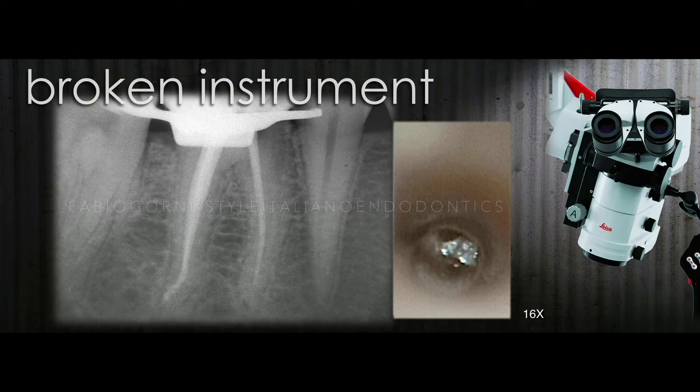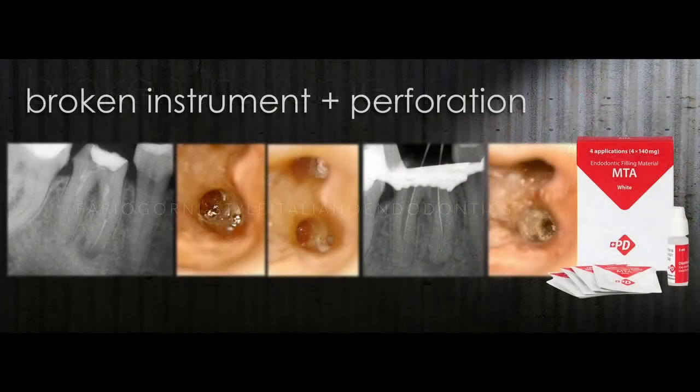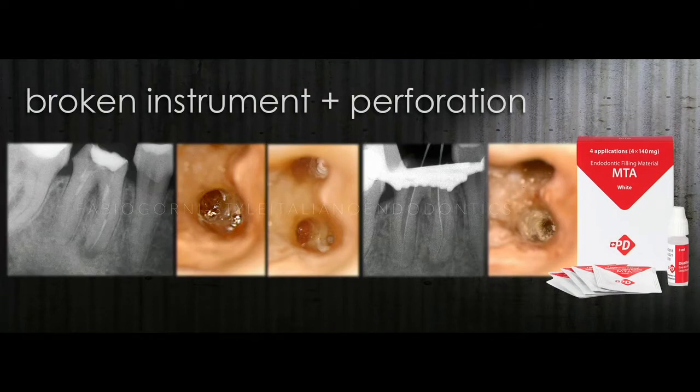When it happens, try to understand exactly if it's possible to realize our project and remove the broken instrument, or if we have to face the case in another way. This is the typical case that I want to show you, and this is what can happen if we try to remove a broken instrument without any expertise and any equipment. This is a typical case that I told you before.